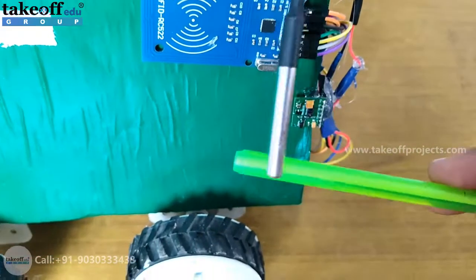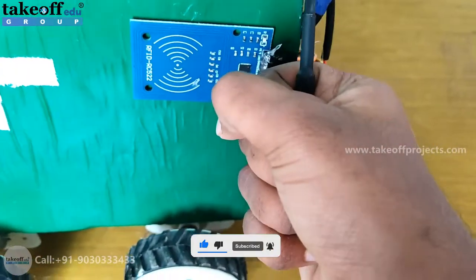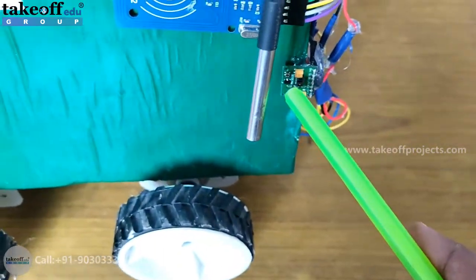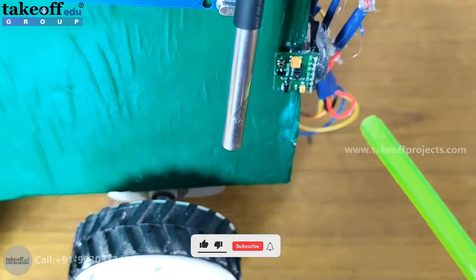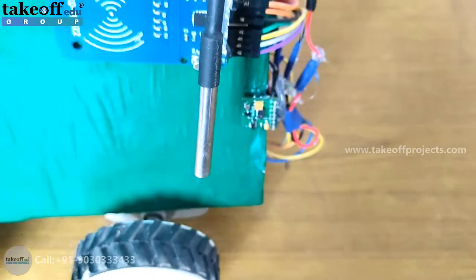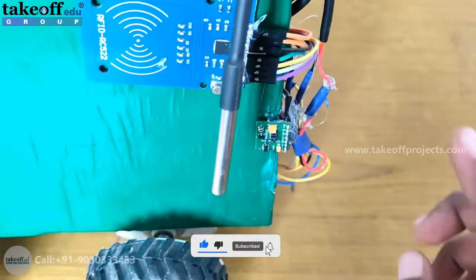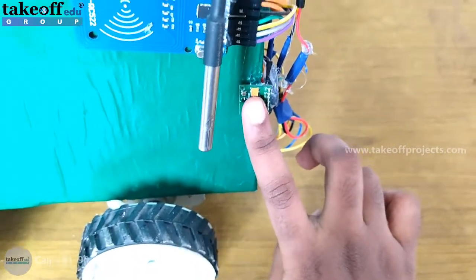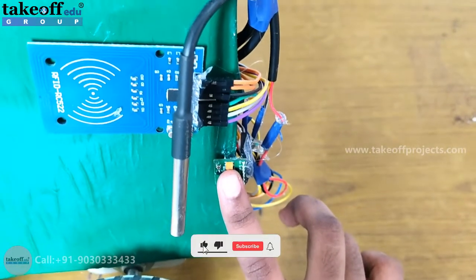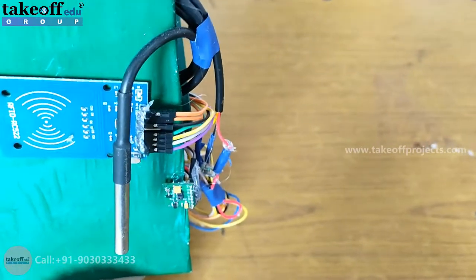Here is the body temperature sensor. The patient needs to hold this body temperature sensor in order to measure their temperature. And this is a pulse oximeter sensor which will measure the heartbeat and oxygen levels of the patients. When the patient swipes the card, they have to place one finger on this sensor for a period of 10 seconds.